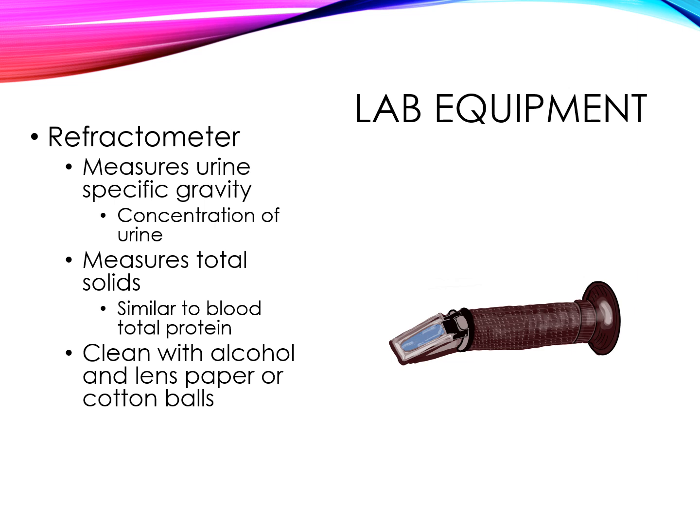It's almost like a little screwdriver, and you put it in there and you turn it until it reads 1 for the distilled water. And then when you're done with these, you always clean them with alcohol or lens paper before putting another sample on it.